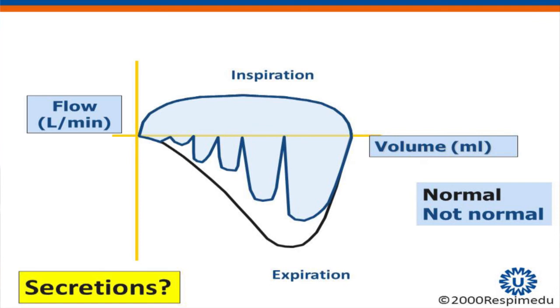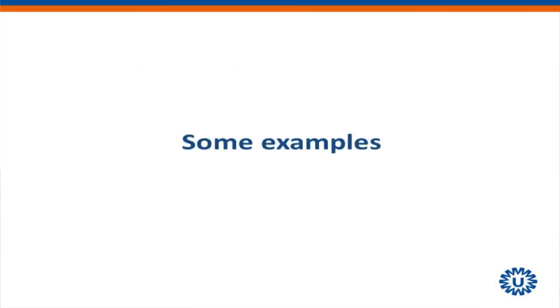Perhaps these are secretions. I have some examples. I'm not going to tell you what it is, but I want you to tell me what it is. They're quite easy, I think.